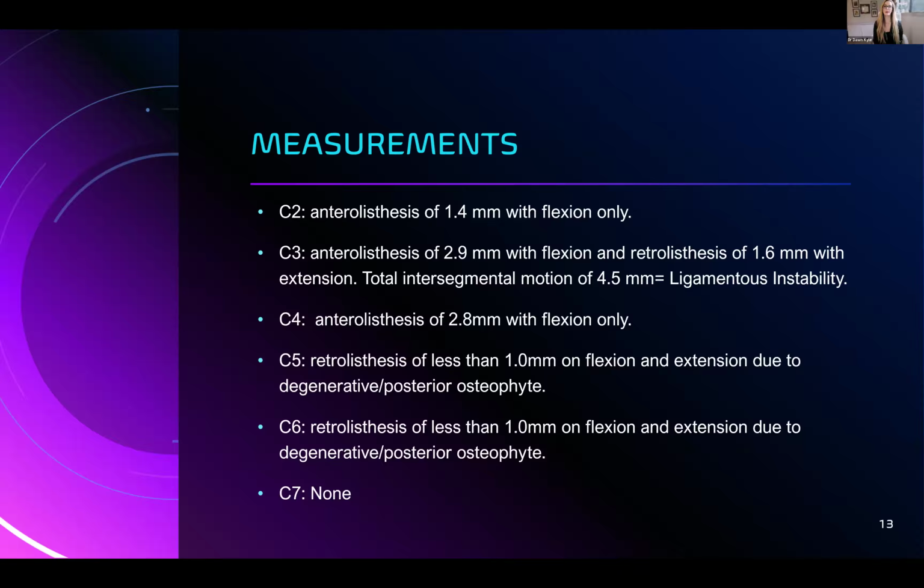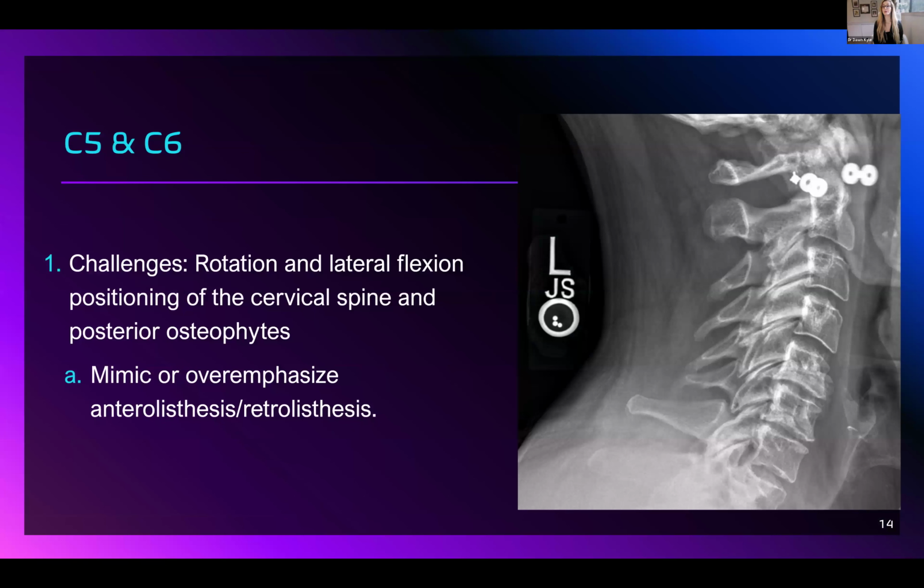Makes sense. And when you've seen thousands of these views by now, do you see a common trend where C3, C4 is getting the bulk of this instability? Is that something you've seen on low impact injuries in general? Yes, it's actually between three segments. The C3, C4, and C5 are usually the most common ones.